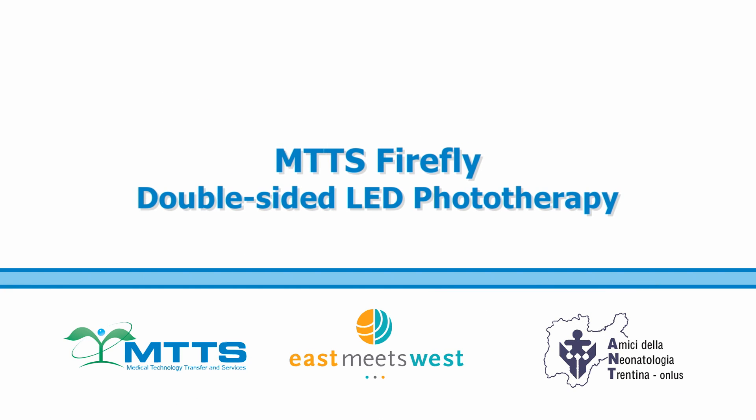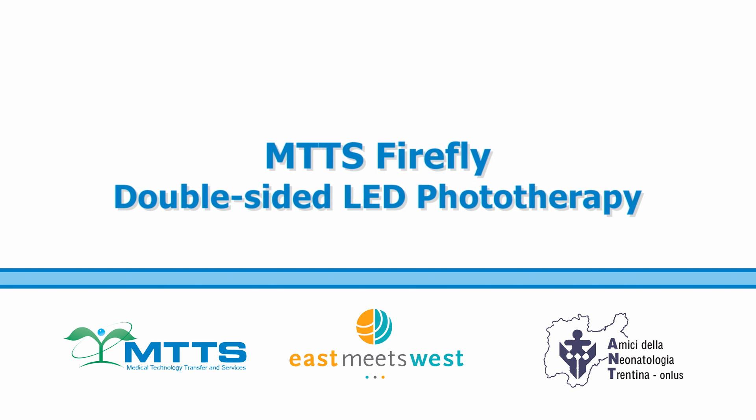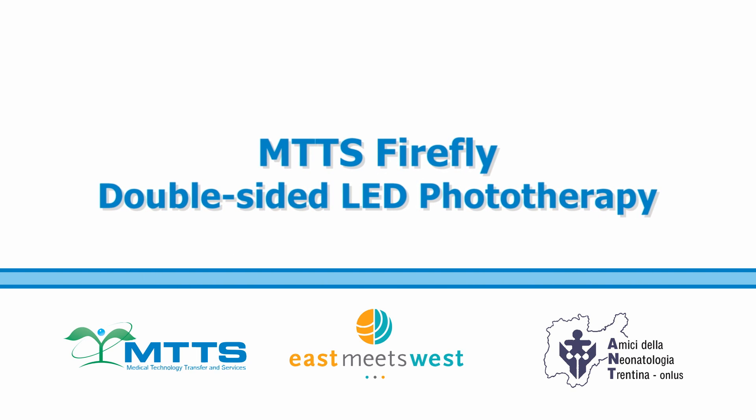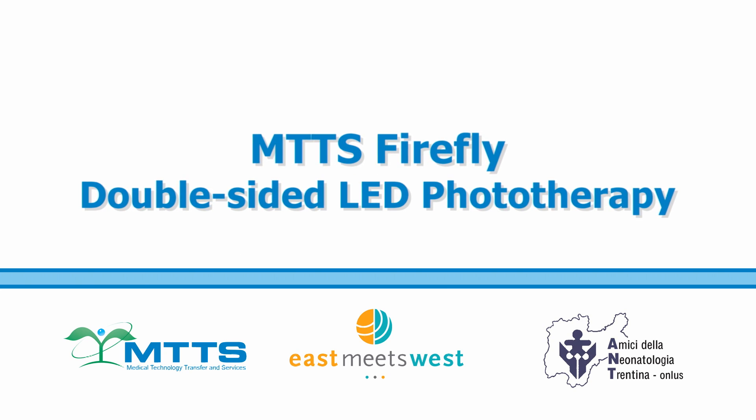This video will cover how to install and use the MTTS Firefly. The Firefly is an intensive double-sided LED phototherapy unit for use in treating neonatal jaundice.